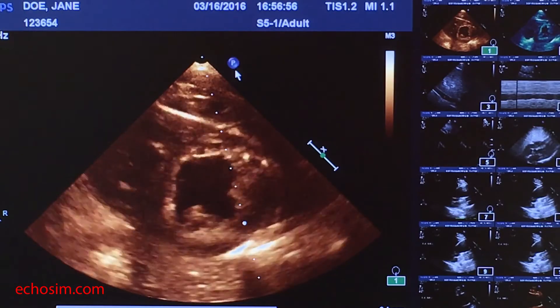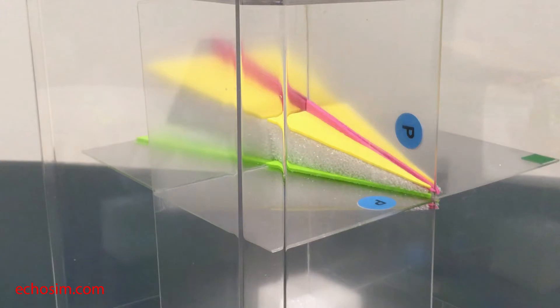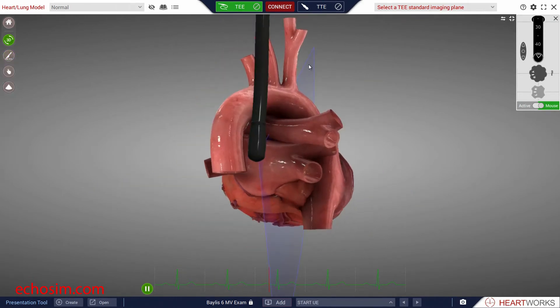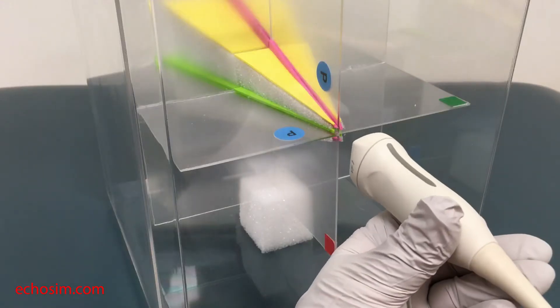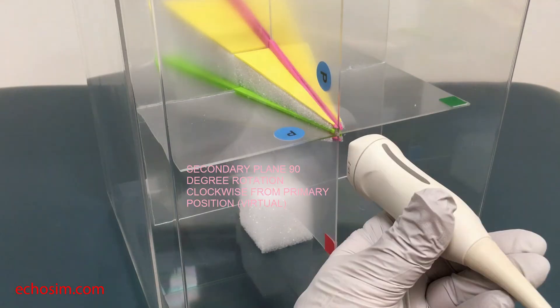Note that the blue plane marker will always appear on the right side of the monitor screen. The default position of the secondary plane is always 90 degrees clockwise to the primary plane when viewed from the perspective of the probe. In other words, the secondary plane can be thought of as derived from rotating the primary plane 90 degrees clockwise. With TEE, the clockwise rotation is from the perspective of the viewer sitting in the esophagus and looking forward into the heart. With TTE, in an analogous manner, the 90 degree clockwise rotation of the primary plane to create the secondary plane is from the perspective of the operator sitting in the position of the probe's cord looking forward into the heart.